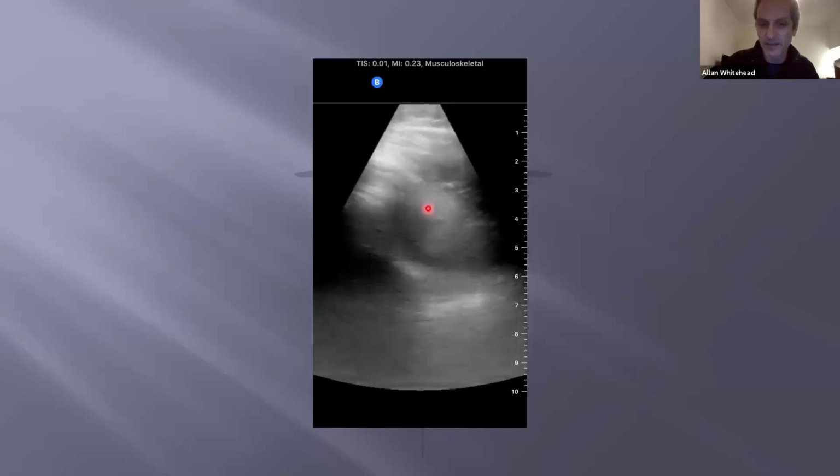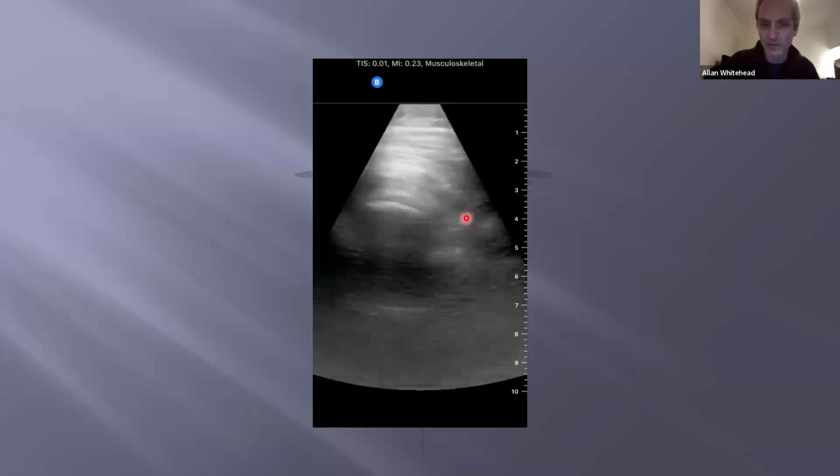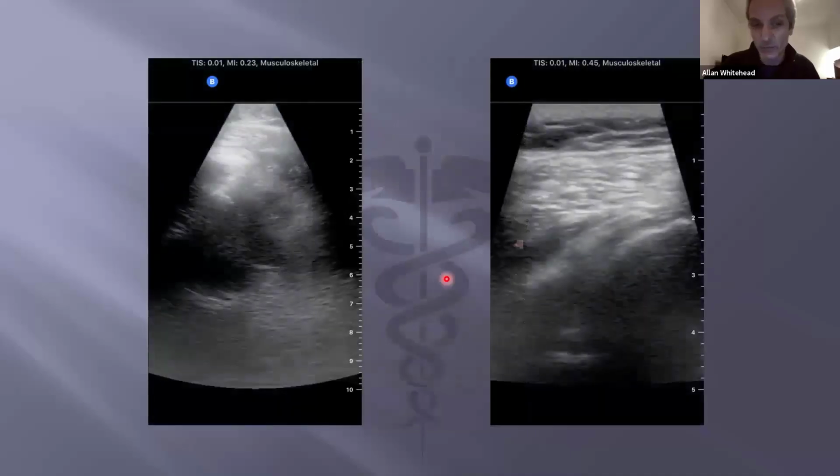And then you've got this sort of blood and tissue in the space where the head used to be. And the head's a good 1 to 1.5 centimeters beyond the glenoid. Then when we go to the next image, which is still probably a bit easier for you, there's that lip of the glenoid. You can't see the full C or S, but you're seeing that nice lip edge. And the head's a bit fuzzy, but it's sitting way down here. Good couple of centimeters, probably even deeper, 2.5 centimeters to almost 3 centimeters from the glenoid lip. So a really well anteriorly dislocated humeral head.